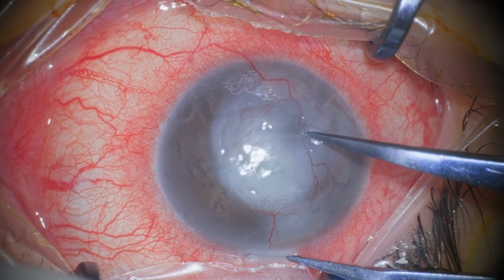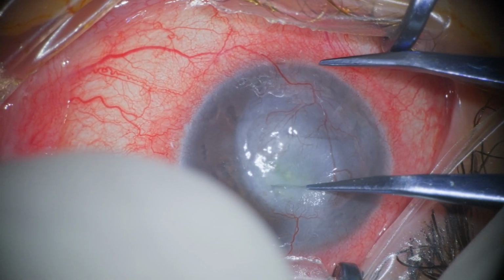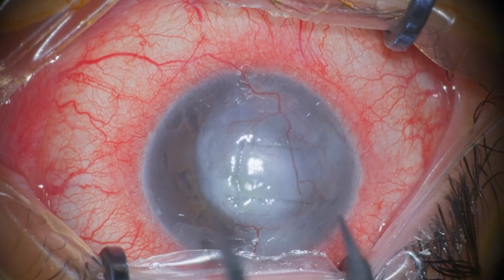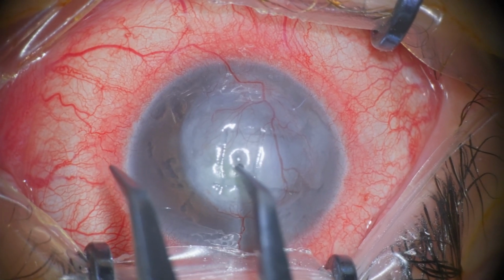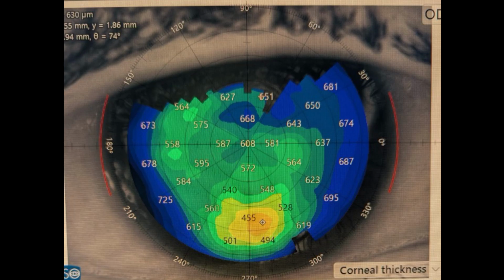Today's case has to do with a 55-year-old lady that presented to us for corneal opacity secondary to herpetic disease. Unfortunately, she had no prior documentation or recollection of how many times she'd had herpes, how many bouts, how deep, whether it was herpes zoster or herpes simplex, or whether she had trabeculitis. So we had nothing to go by. We decided to do a DALK after our assessment, which I'll present to you shortly.